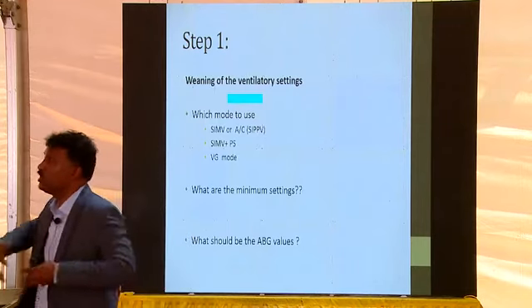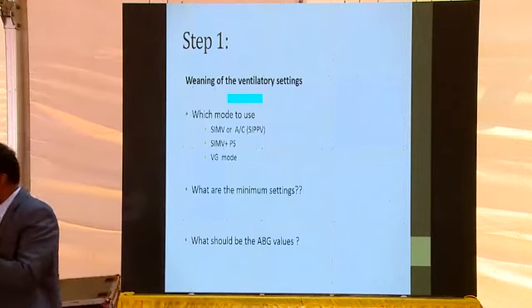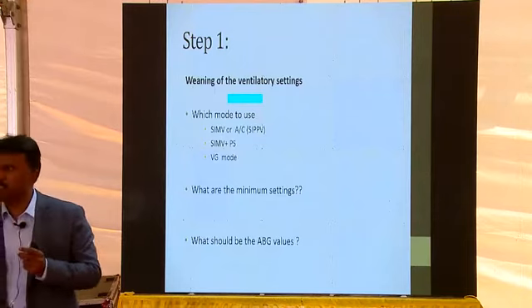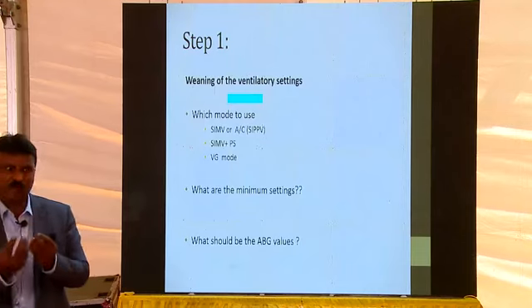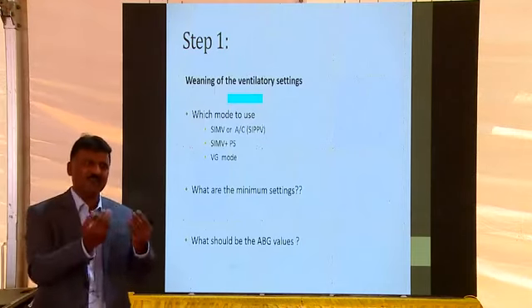Not like I was supporting his breath in total. He was breathing on his own. I was only boosting up his pressures. When I was giving 20, maybe I was giving him too much support. But when he brought it down to 14, I was just giving a little bit.